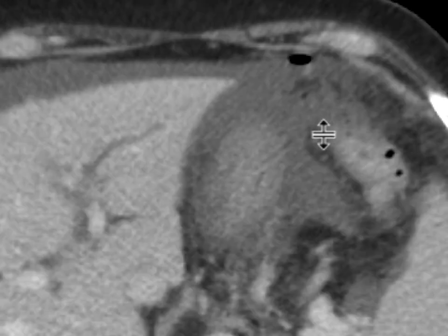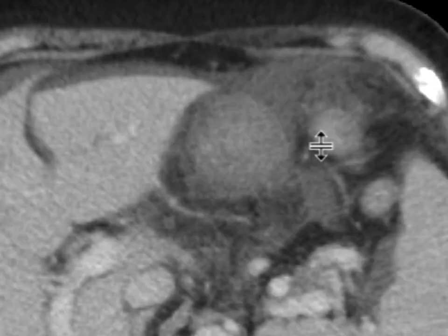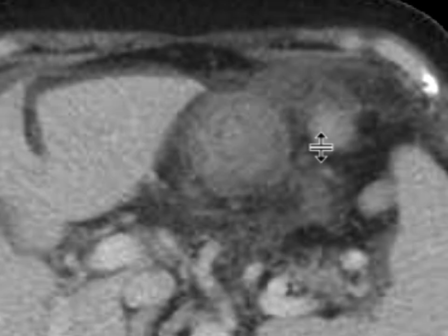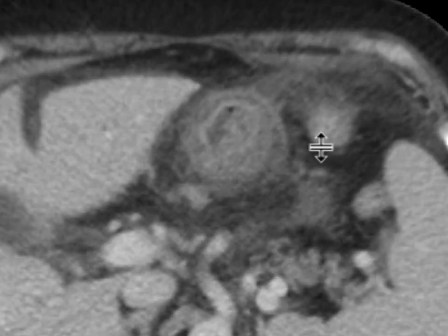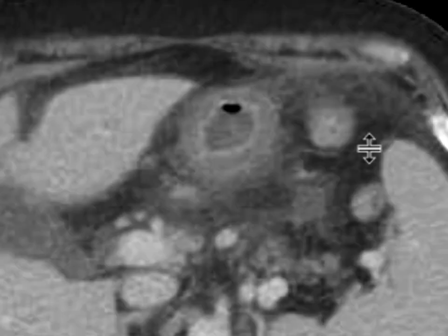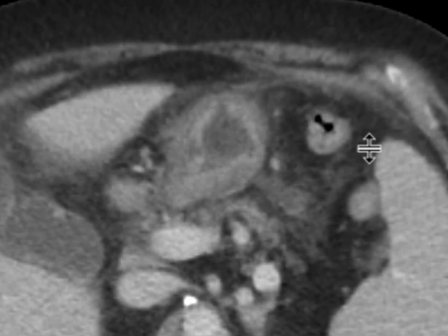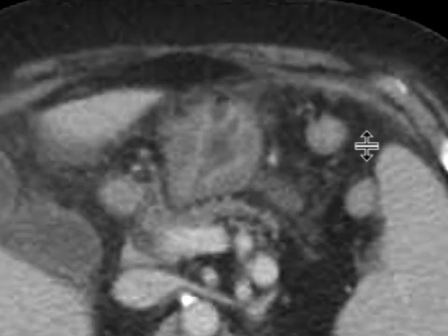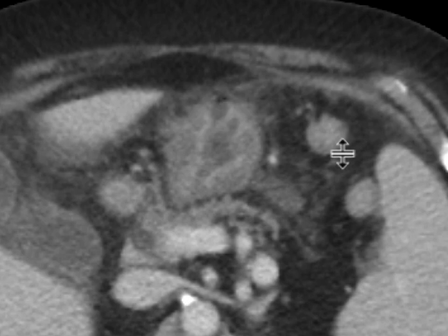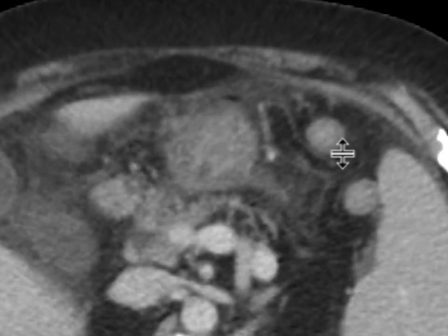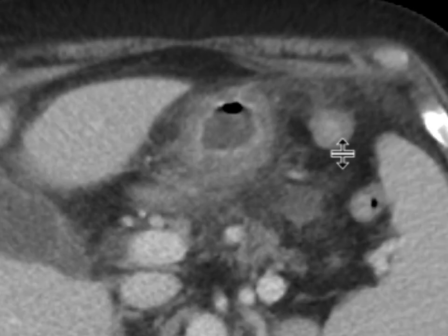If we focus on the stomach over here, it looks pretty good. We can start to see the mucosal lining enhancing here, and right around here we can start to see that focal defect in the stomach with fluid and tiny foci of gas that are extruding outwards.